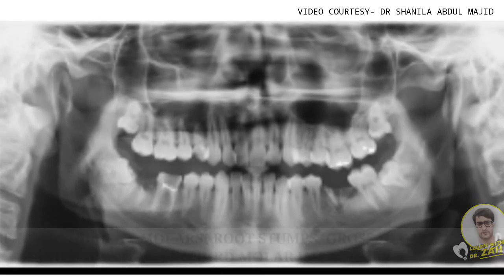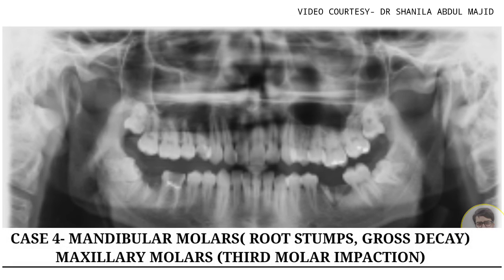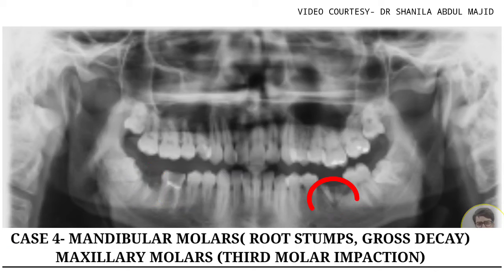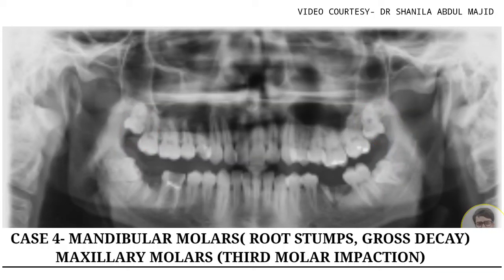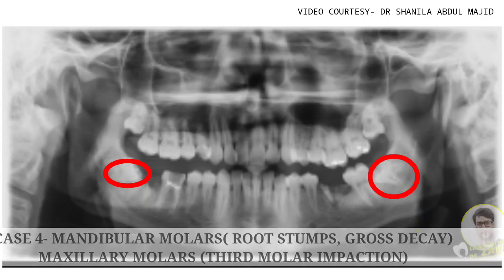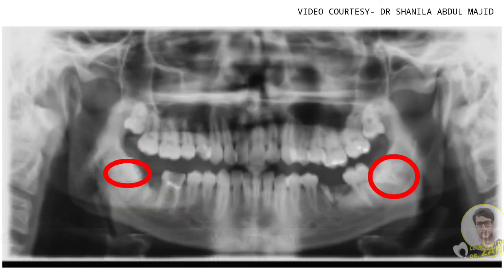The next case scenario shows a lot of retained roots, and the maxillary third molars are again found to be vertically impacted. You can also note that the mandibular third molars are found to be horizontally impacted when compared to the 7s.